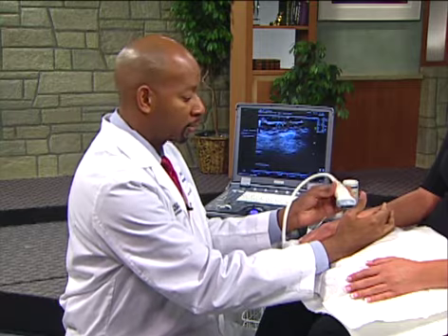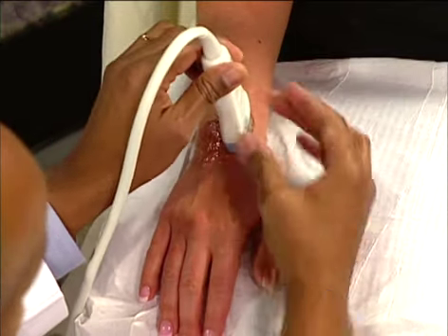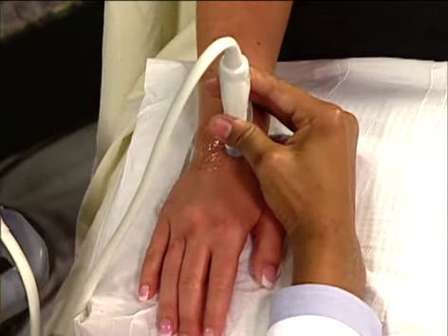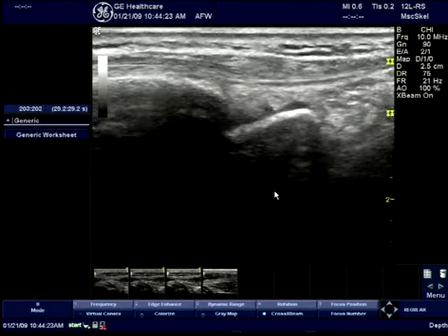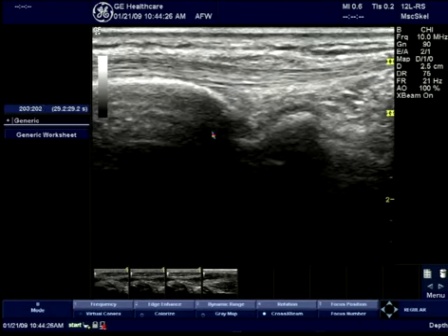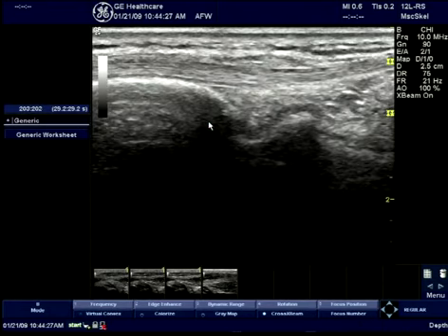In the next scan, we'll look at the dorsal longitudinal scan looking at the radial aspect, picking up the lateral most border of the radial head as it articulates with the scaphoid bone. You can see that on the slide and also illustrated here on the ultrasound image. So here on this image we can see the hyperechoic signal of the radius and then you see the scaphoid. You are also able to see the articular cartilage. We put a little bit of pressure on the transducer and angle it back and forth to look at that region.